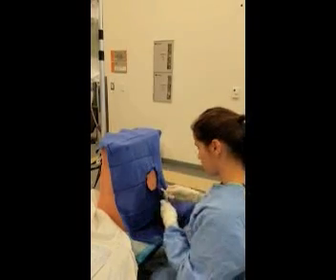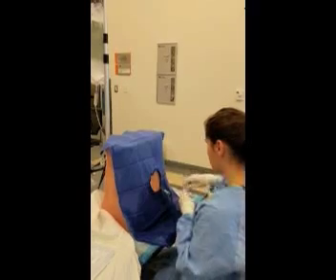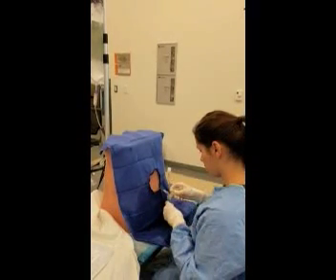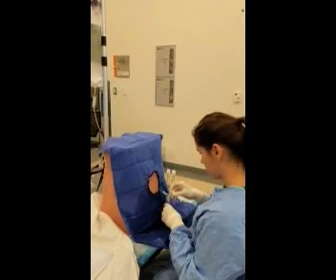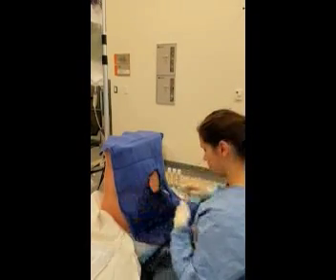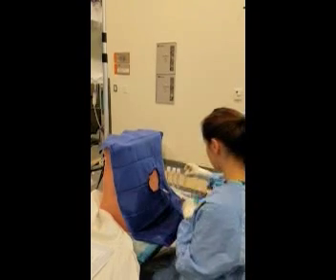Collect about 1 milliliter of CSF in each collection tube. Replace the stylet.